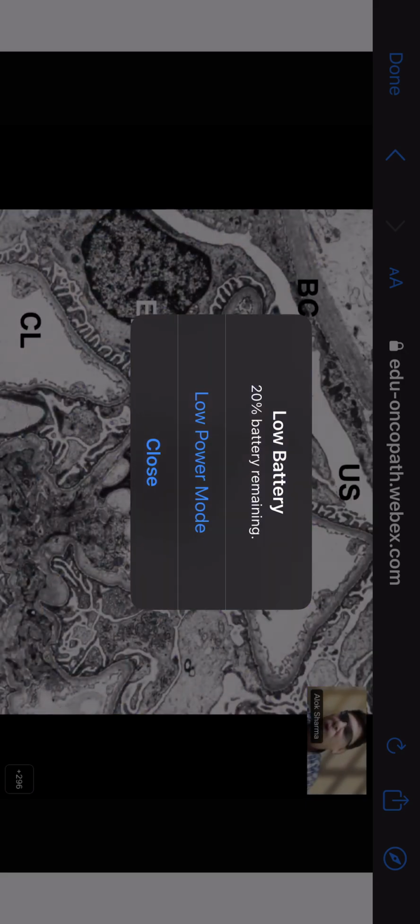And this is how a normal glomerulus would look. Normally you don't do biopsies from normal people, but sometimes you do get biopsies in which the foot processes are preserved. They've been done for some other renal pathology, and this is how it will appear. See, all the foot processes are well preserved. They are giving a hair-on-end like appearance. So this shows you that it is a well preserved biopsy. Foot processes are well aligned to the glomerular basement membrane.